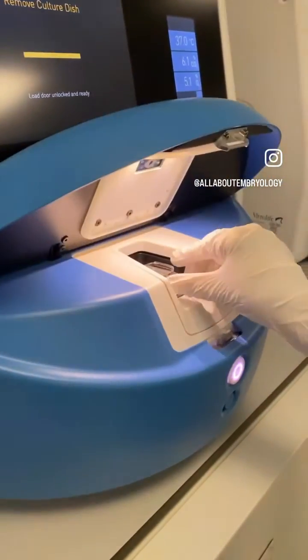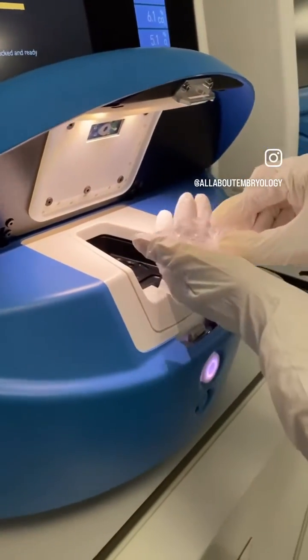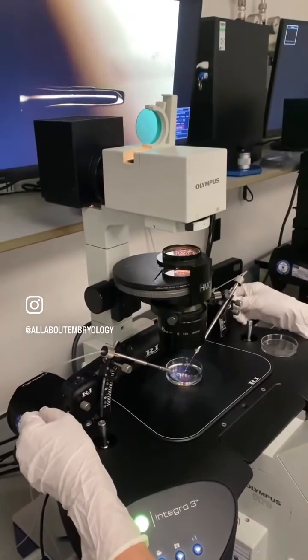Before a biopsy can take place, the embryologist must first check for blastocyst formation. As the embryos will have been hatched on day three, ideally the blastocyst will also be herniating at this stage.